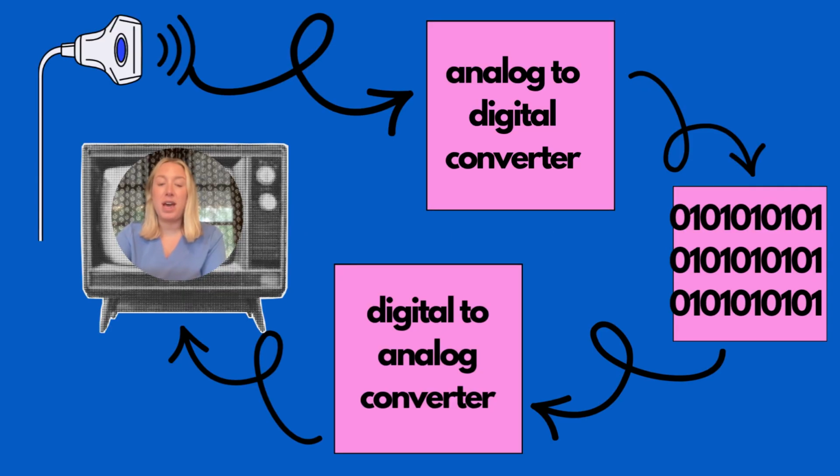Next, the pulse goes to the analog to digital converter. This transforms the returning echo from the receiver, which is analog data, into digital data that the computer can read and understand. This step is essential because all of the image processing and display functions in our ultrasound system happen digitally. This allows the system to build and display the image that we see on our ultrasound screen.